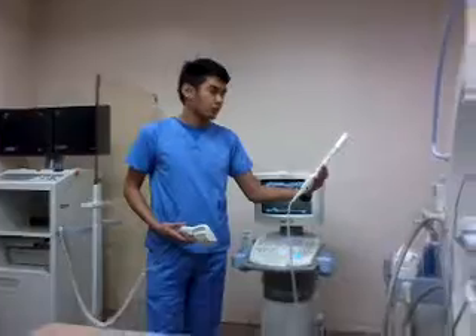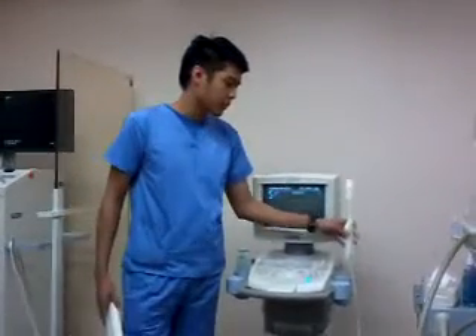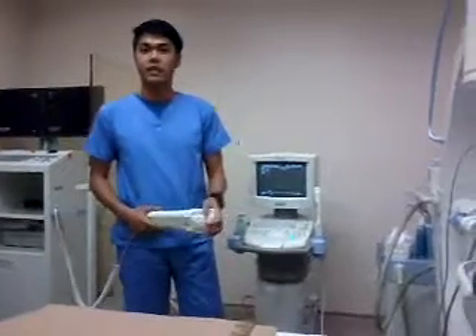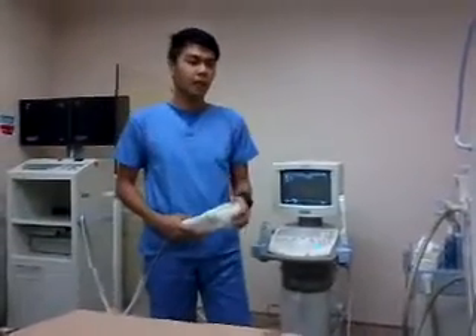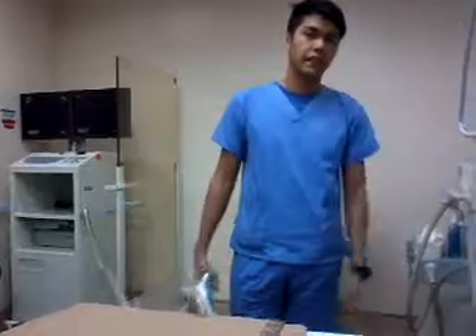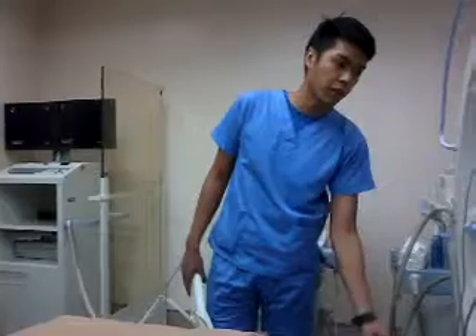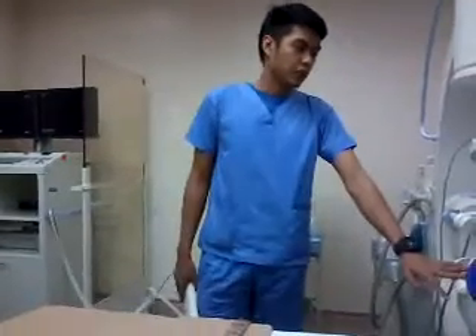This is the transrectal probe for the prostate procedure. The patient is placed on the table, then we raise the bed — the bed is motorized so you can maneuver it however you wish. We lift the patient until the target area is positioned at the lower back level.